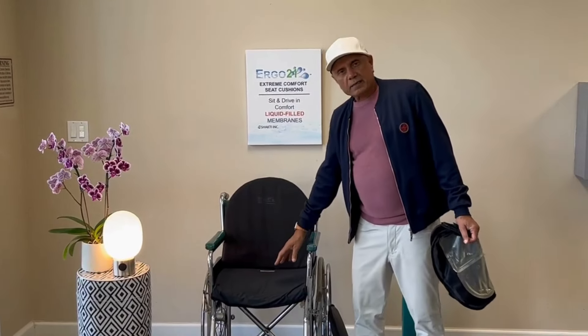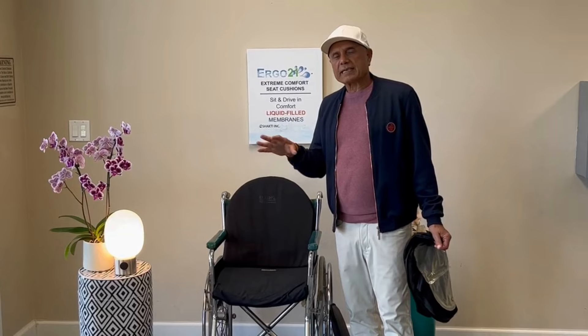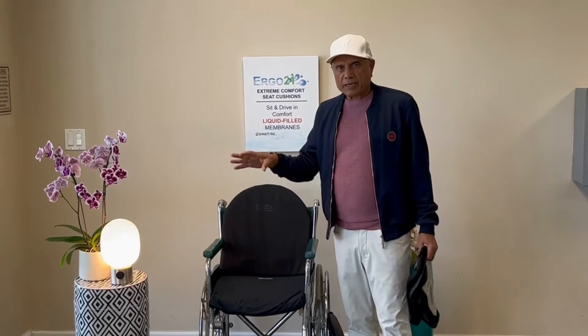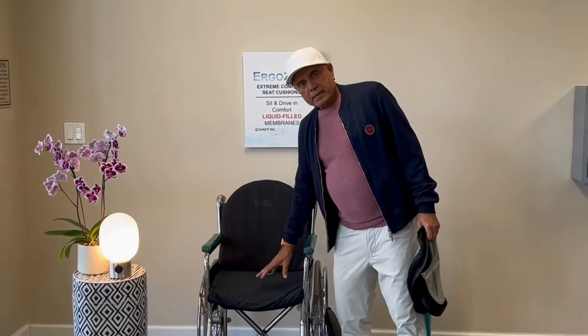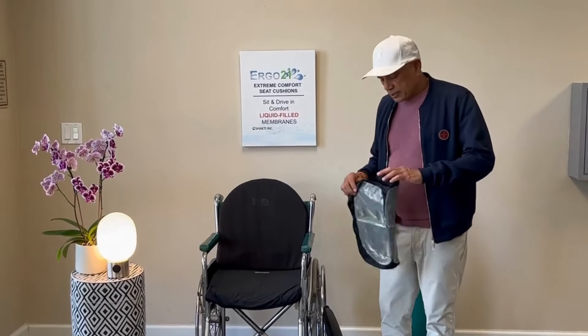The Ergo 21 — even though it's called 'Sports' — is a wheelchair cushion that can be used on an office chair, SUV, patio chair, or in the wheelchair. We have this cushion in five sizes.